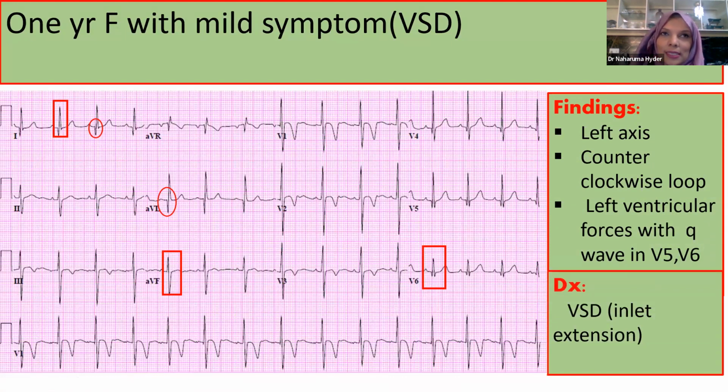In inlet VSD, endocardial AV canal defect, ASD primum, there is a defect in the endocardial part. So there is maldevelopment of the left anterior fascicle, and this patient presents with left axis. So this axis helps us in the classification of the VSD. And if an echocardiographer misses the inlet VSD, we can tell by cross-checking this ECG, because inlet VSD we cannot close by transcatheter closure, and in surgical closure there may be a chance of pacemaker.